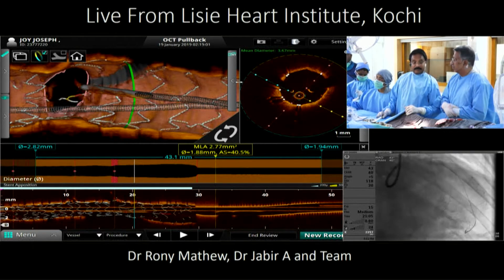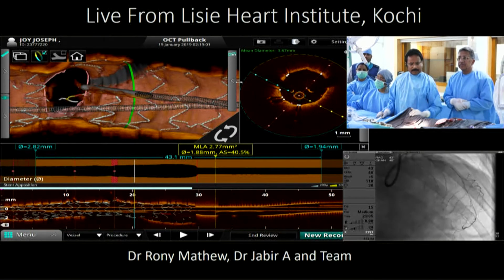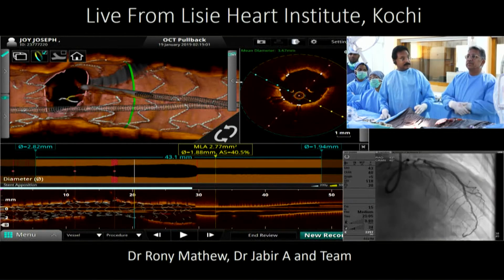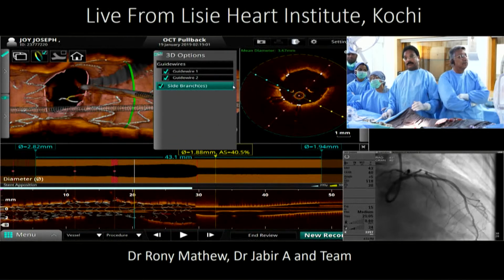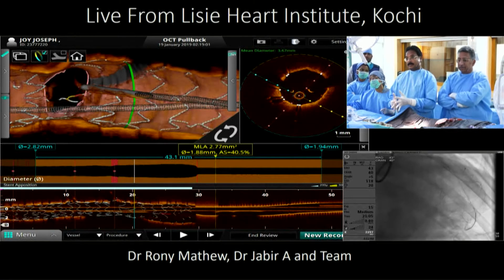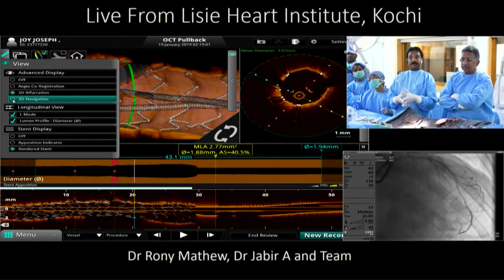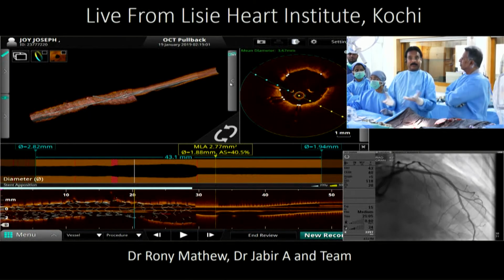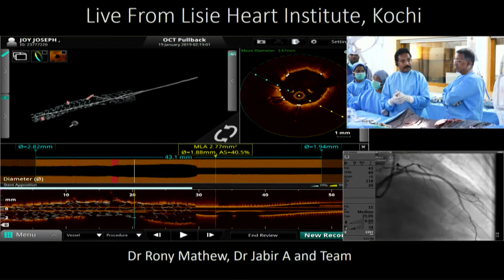It may not be easy to get data on that, but what we have seen in maybe 20-25 cases is 4 cases with neo-carina formation at the strut which was across the circumflex ostium, which produced a significant restenosis. You may consider it anecdotal, but the insight is given by OCT, which only comes late, while we have been guided by angiographic pictures alone for many years. So it may be a new thing, but we have to study it.